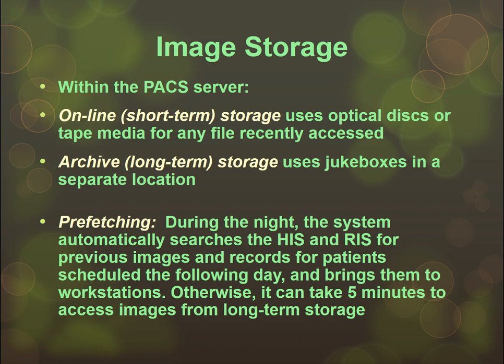And last but not least, prefetching. During the night, the PACS system will look in the HIS and RIS and see who's coming in the next day, and it will go and find the comparison studies and pull them out of archive and put them down into the local systems, cache them on the radiologist workstations.